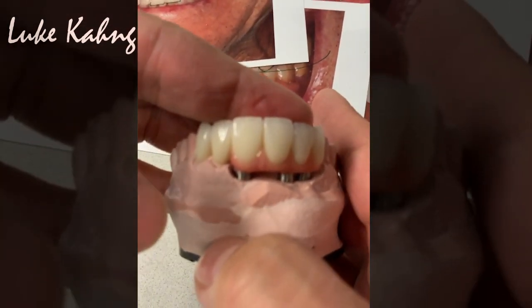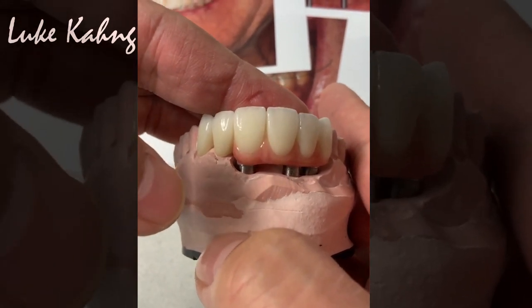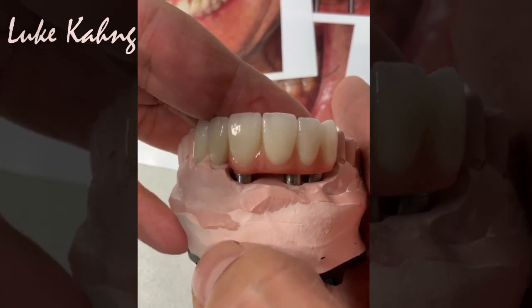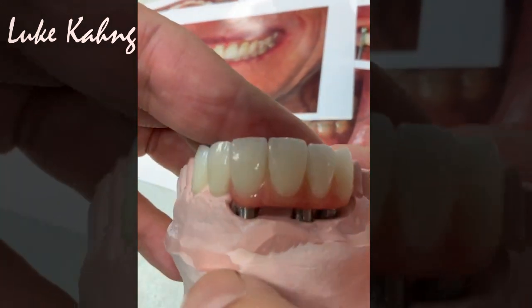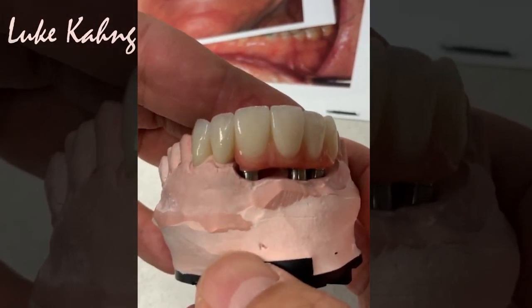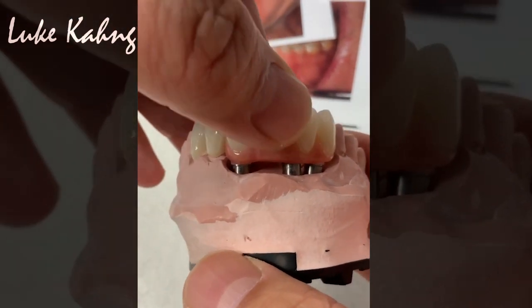But this one, the facial contours with a great translucency, it's a crack line. Everything you see, the color. Okay, you go down a little bit. Yeah, you see color is better. Awesome. All right, so now we're going to cement it together.